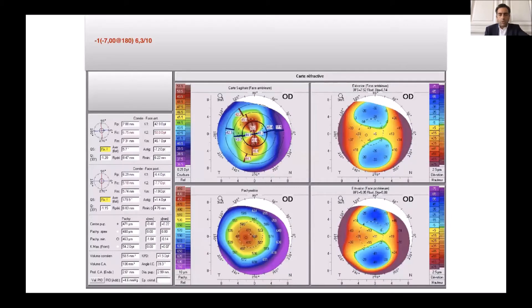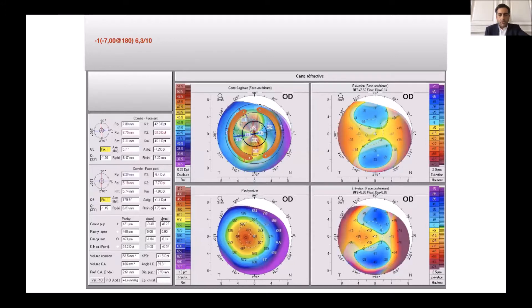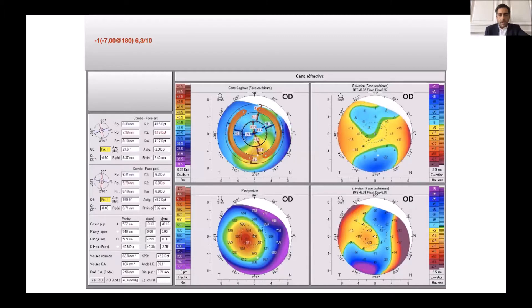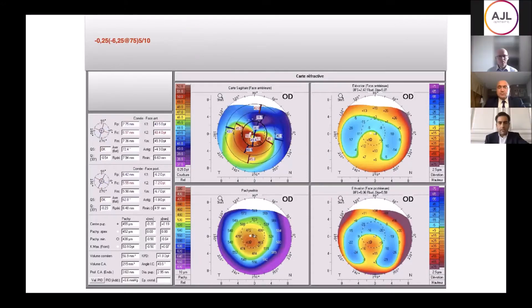I want to show you some examples. This is the case of minus seven keratoconus astigmatism in the bottom form. When we put two intracorneal ring segments from each side, you see the progression. And after four months, we are at only minus two of astigmatism with 10/10 vision.